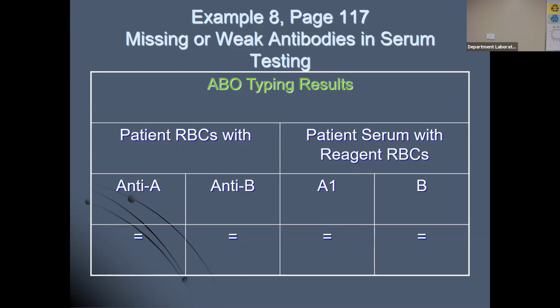Okay. Anytime you do any additional testing, if there is not a place to record the additional testing, like anytime you do A1 lectin and A2 cells, even if you're using a computer, there's going to be truth tables built in where you can enter those results. Otherwise, if you're just writing it out, you'll have a place to record those results.